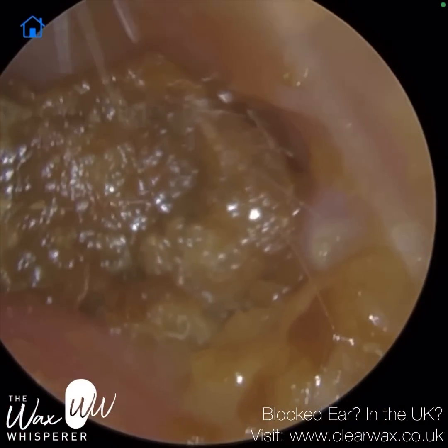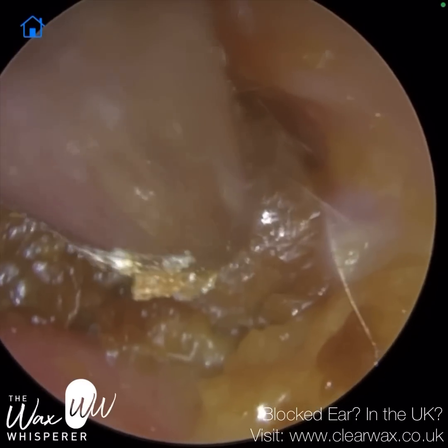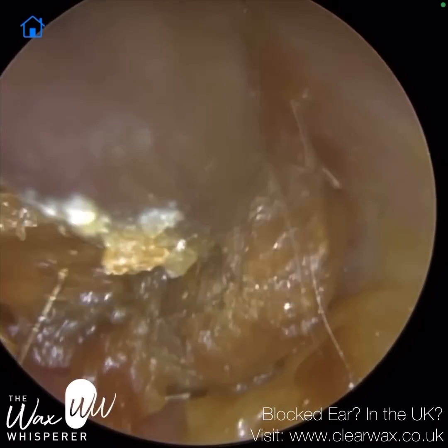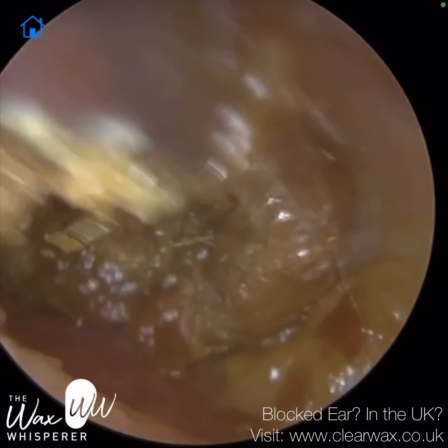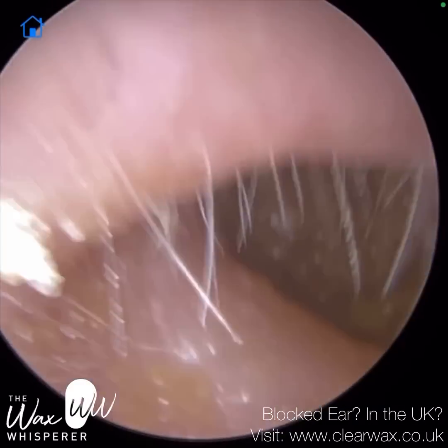You can see I was just trying out the zoom there to view that wax — I didn't particularly need it for this part. With the wax scope, it actually incorporates a speculum, and the reason why we developed the wax scope is it's a bit more user-friendly than the endoscope.